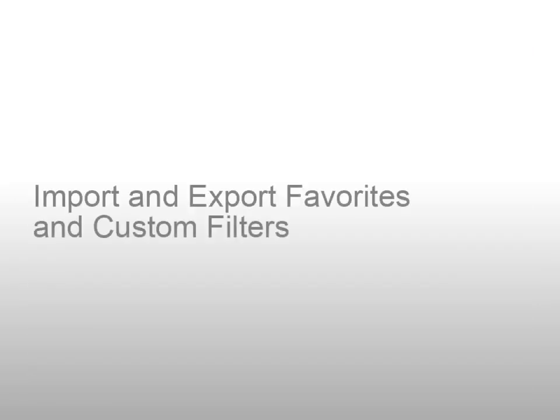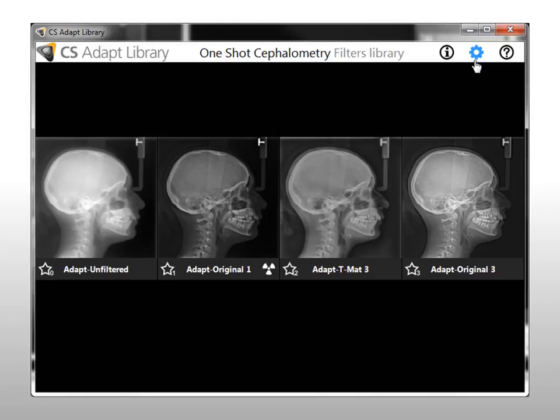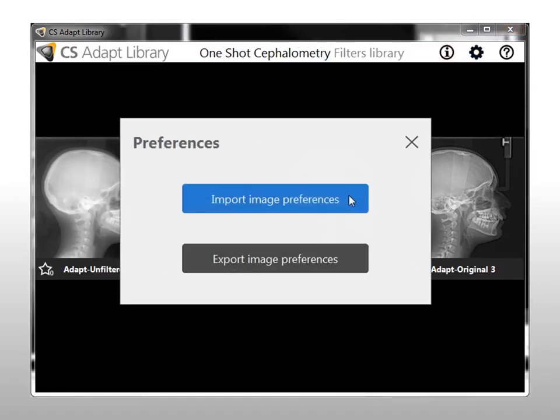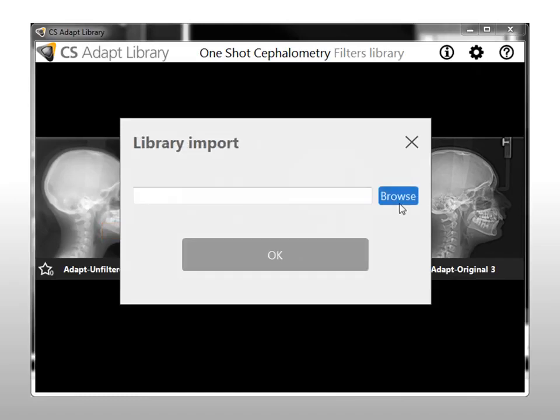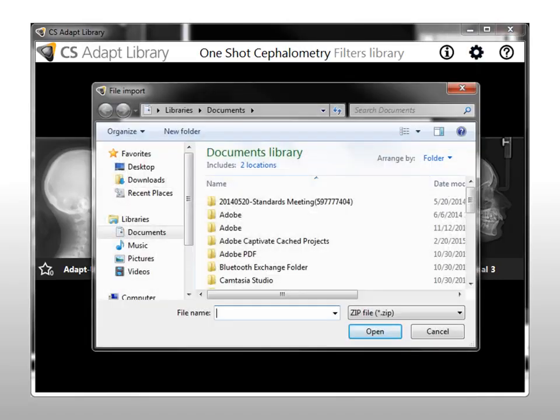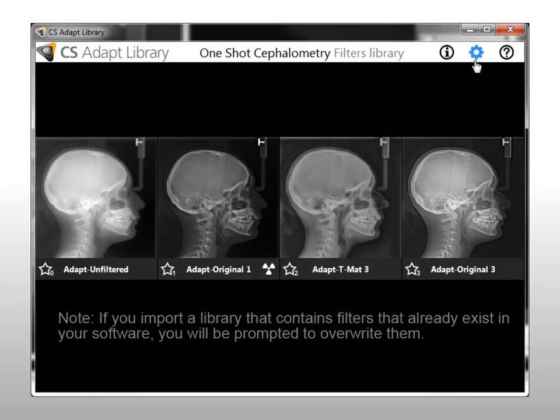Import and Export Favorites and Custom Filters. Libraries of favorites and custom filters can be imported and exported as zip file archives. In the CS ADAPT Library software, go to the System icons and click Preferences. In the Preferences window, click Import Image Preferences or Export Image Preferences. Browse to the relevant folder, select or specify the zip archive you want to use, and click OK. Note: if you import a library that contains filters that already exist in your software, you will be prompted to overwrite them.